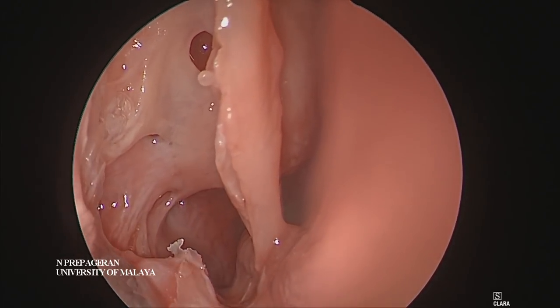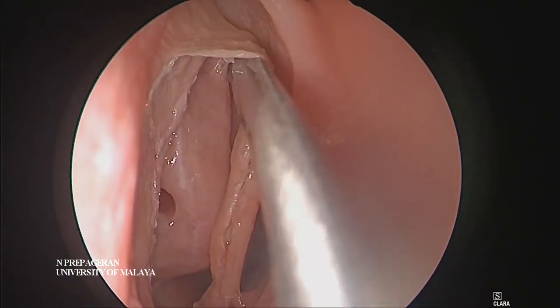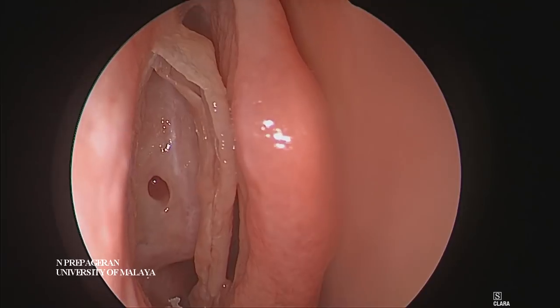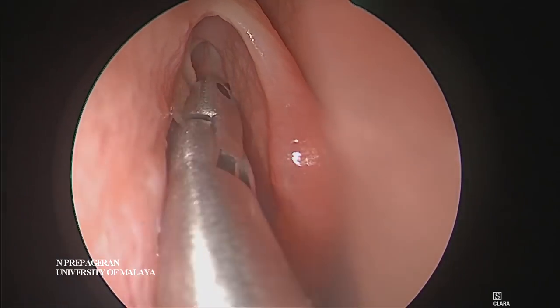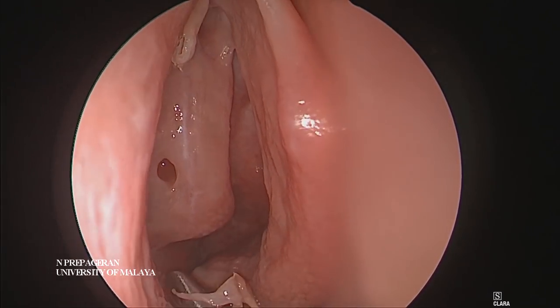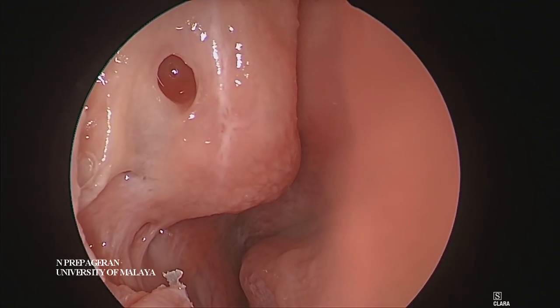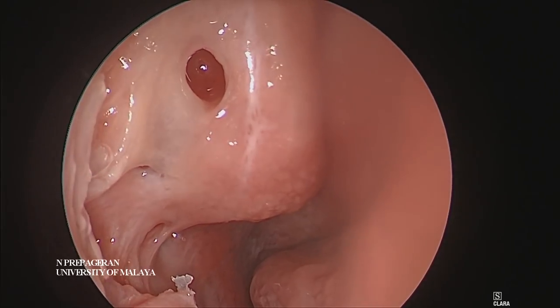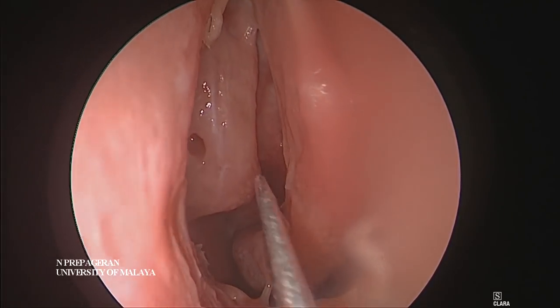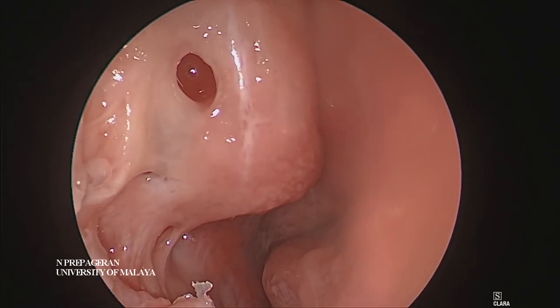That is the tail of the uncinate process. If you dissect the tail of the uncinate process nicely, you will usually end up looking into the maxillary ostium. So this is the uncinate, which is the first gate. I always like to leave a small bit of the upper part of the uncinate, because that will give me my landmark to do frontal sinus surgery later. So now if you look here, the maxilla will just be at this corner — at 7 o'clock there. So you can actually enlarge the maxillary ostium by using a simple Freer's elevator. And you can see that's the maxillary opening here.